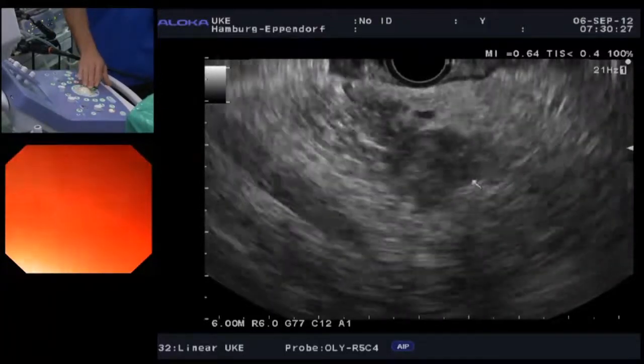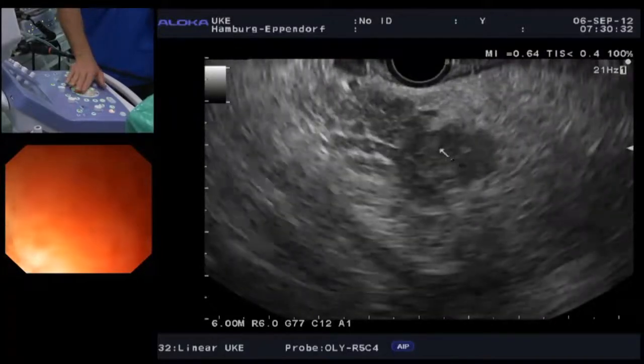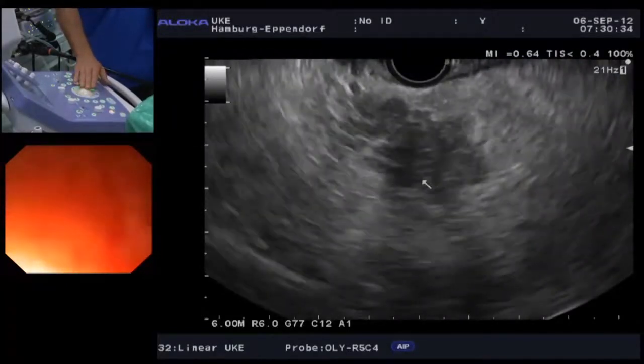That's a little bit abnormal there, isn't it? So I think this area there is a little bit bothersome to me, Mike.